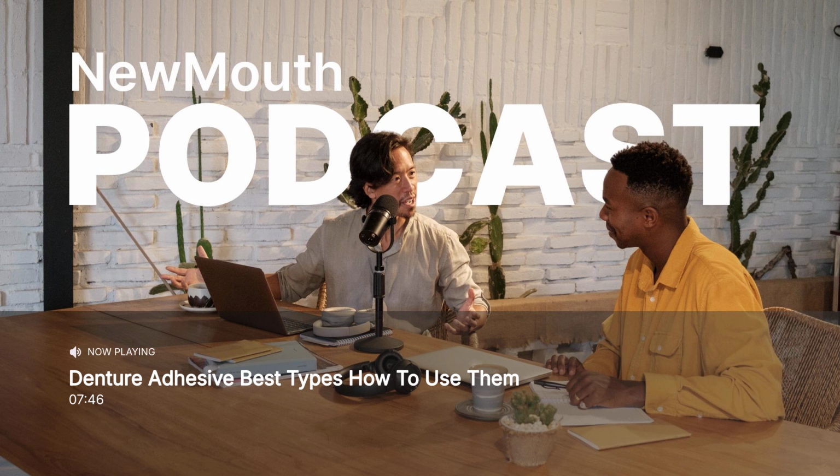Right. It's all about finding what works for each person, right? What you like, what you don't like, how long you need it to last. Everyone's different. Absolutely. No one size fits all. So it's about finding the right product for sure, but it's also important to remember that even though these adhesives are super helpful, they're not a permanent solution if the dentures just don't fit right. Right, right.